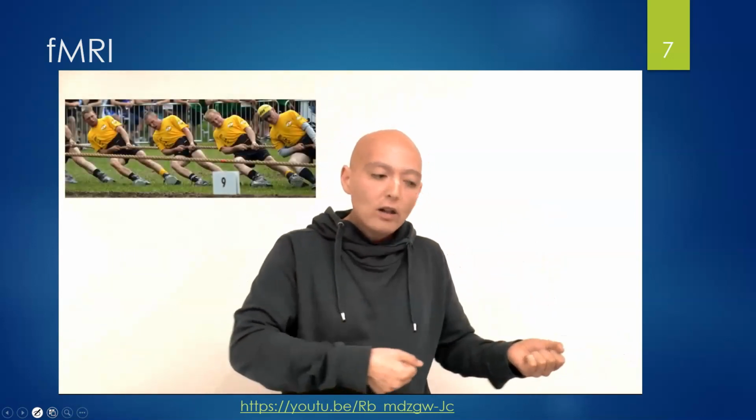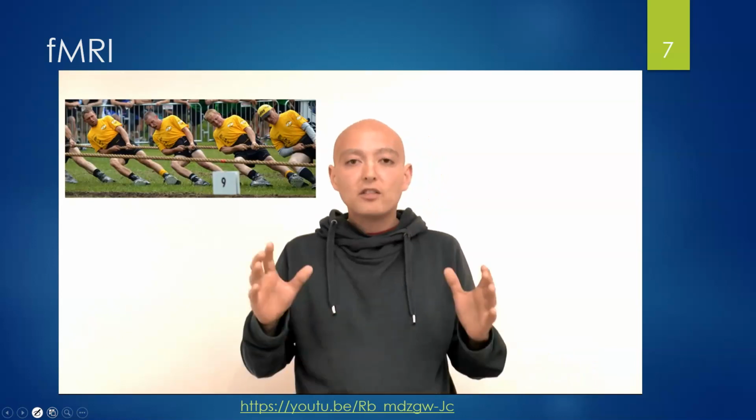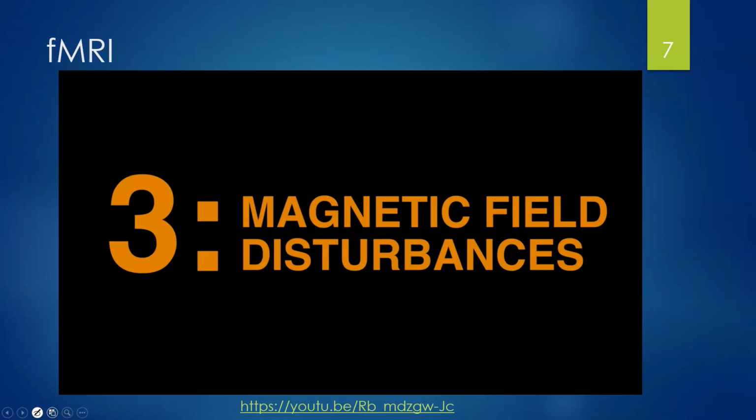That's like a team of tug-of-war pulling on a rope. They all have to pull at the same time so that their forces add up. Now, with time, as the water molecules desynchronize, your signal becomes weaker and weaker and weaker. And with that, we're now ready for the final piece of the puzzle.